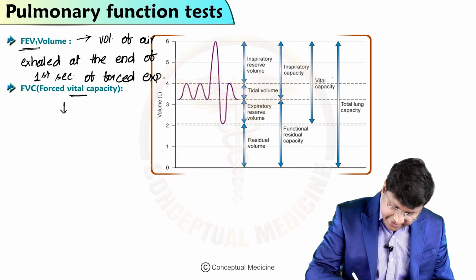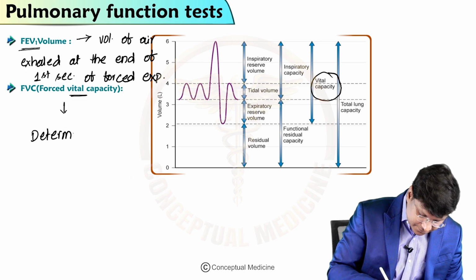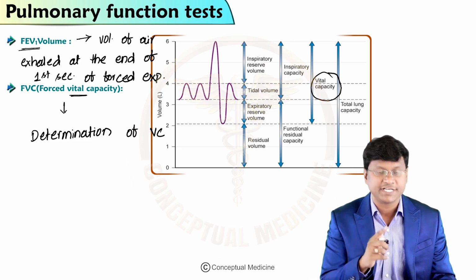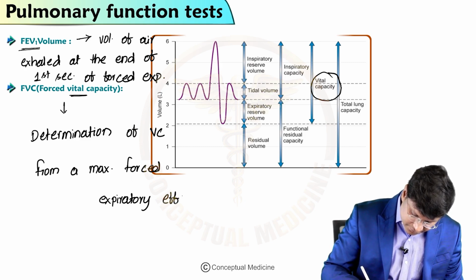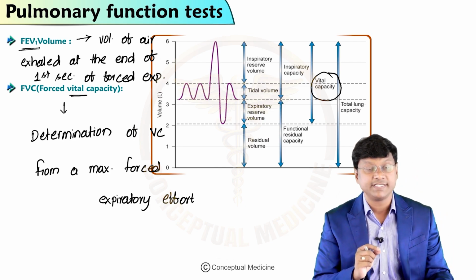You see here, this is the vital capacity.